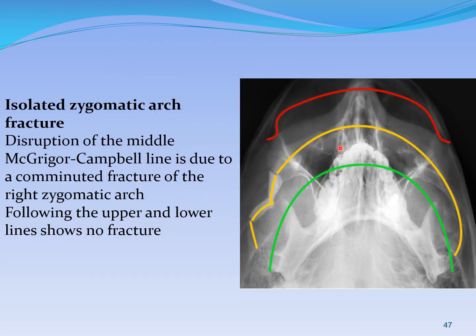So this is a classic example of facial trauma. Once you get a Waters view and start drawing the lines, the red line is drawn properly. The second line, the yellow or orange line, when you are marking it, you can see there's discontinuity. Wherever there's discontinuity, the line is also drawn as a discontinuous line. Wherever there is discontinuity, that means there's a fracture.